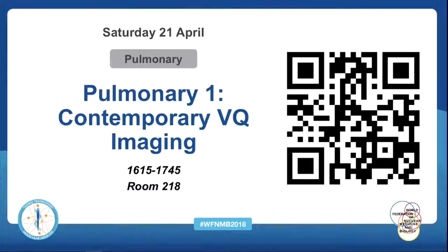To be honest, I think in the US in particular, which dominates things, the lung scan is done suboptimally. CTPA came along. The clinicians get an answer. That's what they want, not a probability. They want an answer. The respiratory clinicians also want other information, to know if there are any other pathologies going on. CTPA is very good at that.